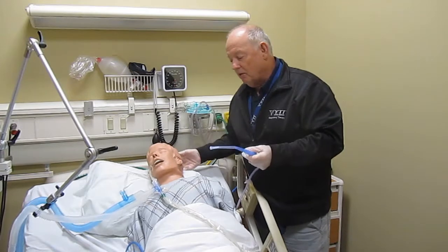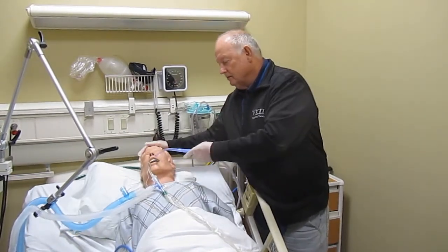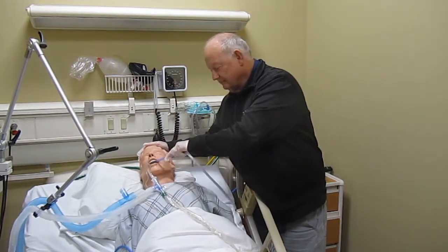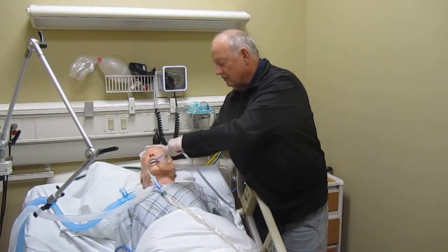This is often used to suction the airway before intubation. Gonna suction out your throat there. Just put that right in there and suck around.